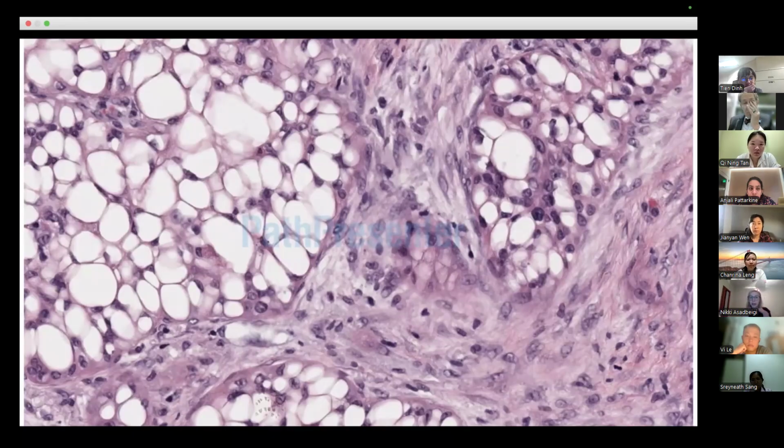In adenoid cystic you're having those empty spaces, and that's a very good thought because you're having these white spaces, but they're going to have more of a glandular component to it. But these white spaces you're seeing here are single cells. This is not a glandular component. That's the reason I said this is very high power. This is probably something around 40x, and that's the reason you're seeing these white spaces. They look very large, but these are single cells.